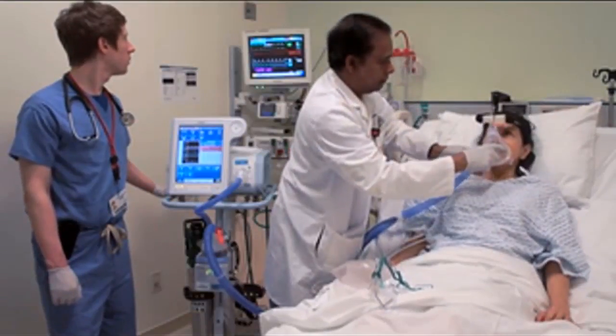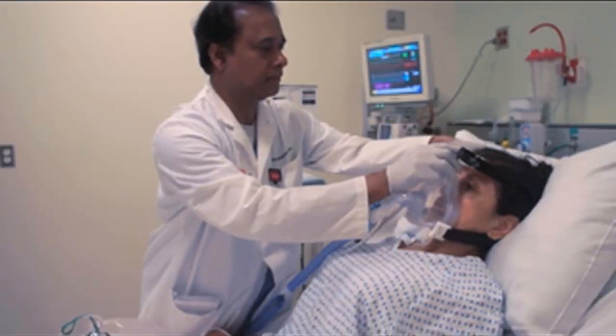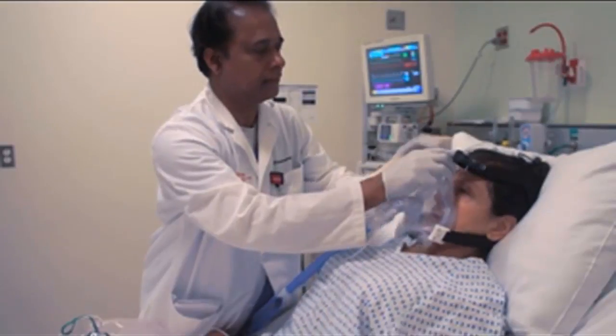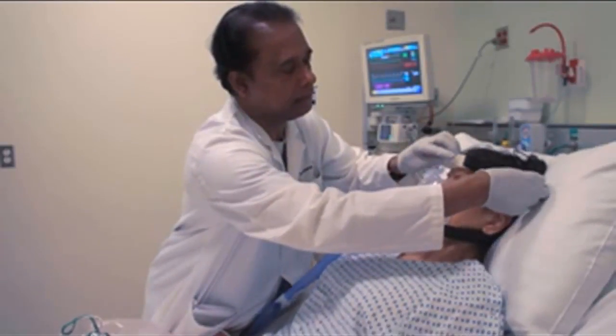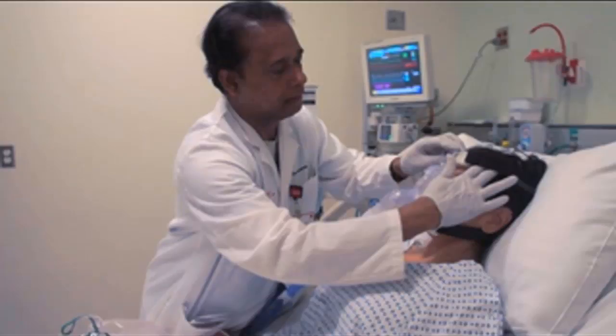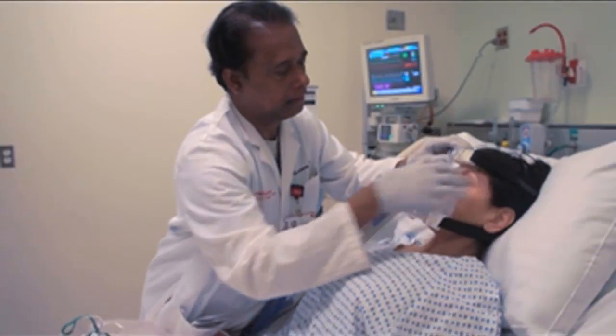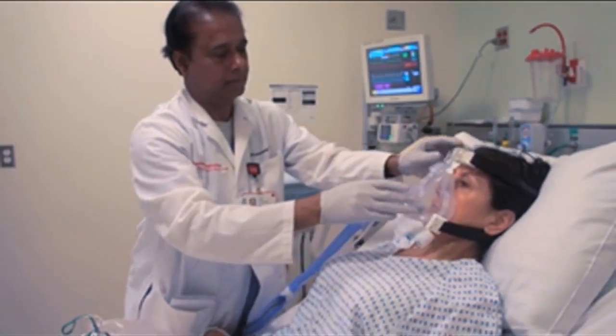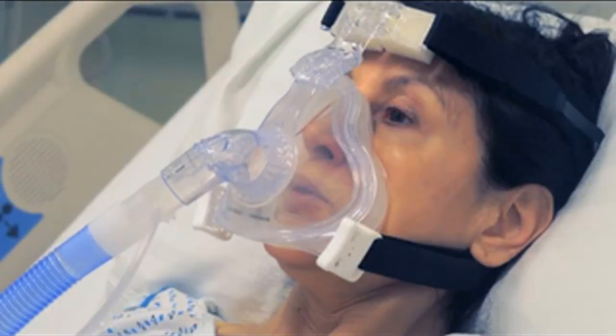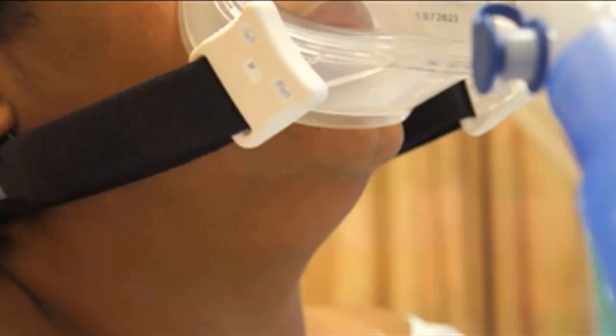Next, apply the mask to the patient. Be sure the straps are tight enough to secure the mask without causing unnecessary discomfort. You should be able to place two fingers easily between the straps and the patient's head. The mask should fit comfortably over the nose and mouth without extending beyond the chin. Another example of the correct fit is shown here.